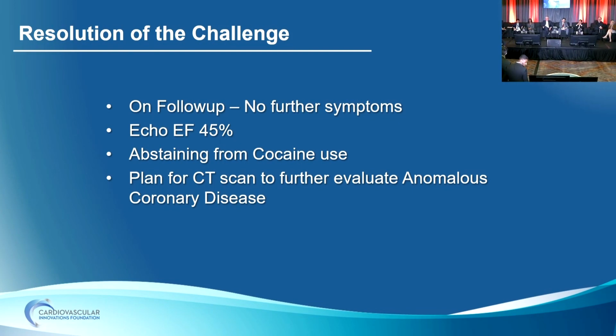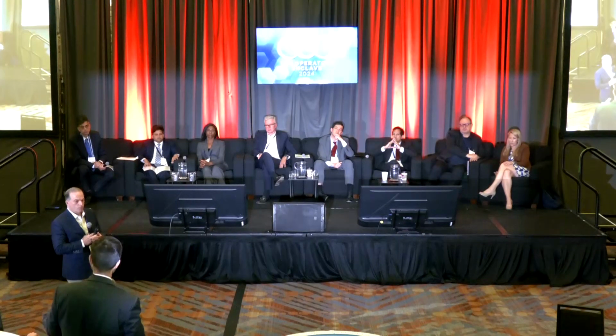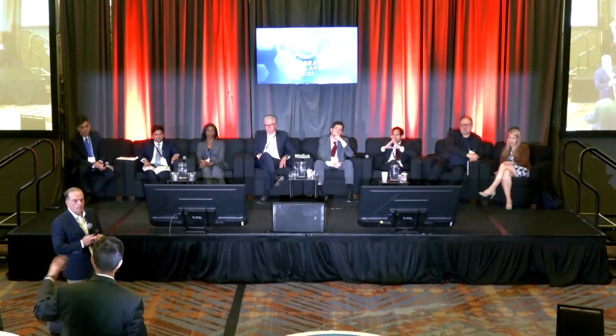About a year ago, a 52-year-old gentleman, construction worker, had an inferior MI. It wasn't an anomalous coronary, but a huge right coronary, and it was full of clot. So I wired it, used Penumbra, and a balloon. I got TIMI 2 flow, but when I was about to stent, it was extending the whole thing. I wasn't happy to put a device there, and so I stopped. I said, I'm going to put him on Integrilin overnight, see how he does, and bring him back later.